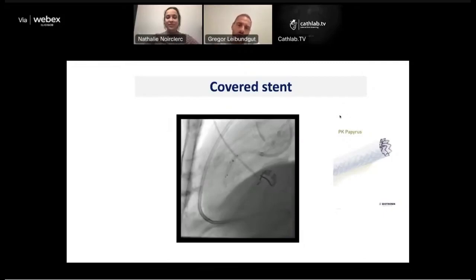So I think the most important thing is to keep the hands down of the patient, because he starts moving and tries to take out your wire, and you lose the whole access. So first, make sure you keep access with the wire. Everything else is secondary. And then the second thing is the pericardial drain and the blockage of the inflow, and then you basically have all your time to do the rest. Yes. That's a very good comment, yes.